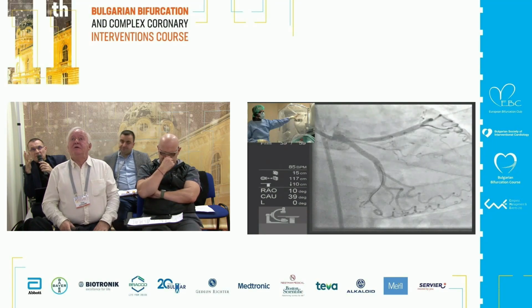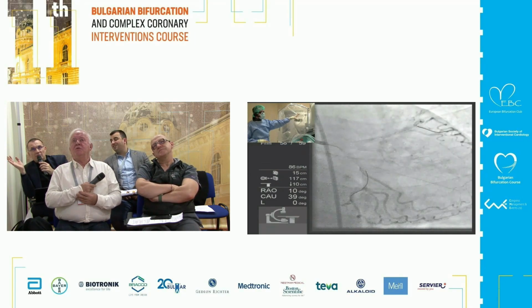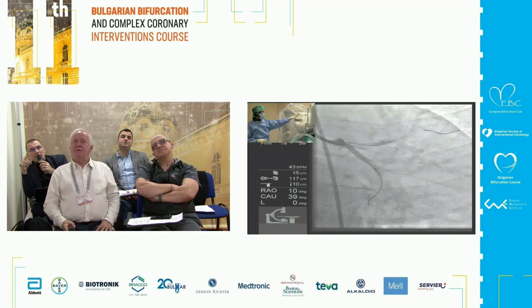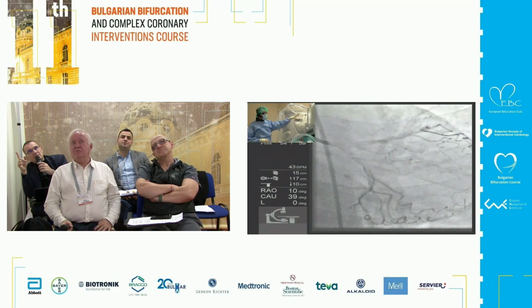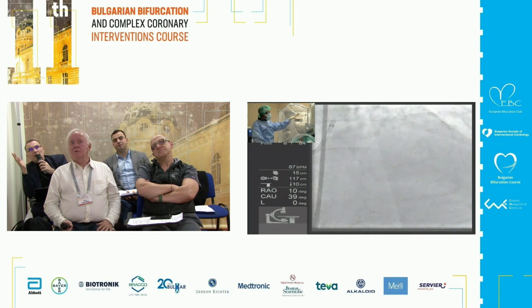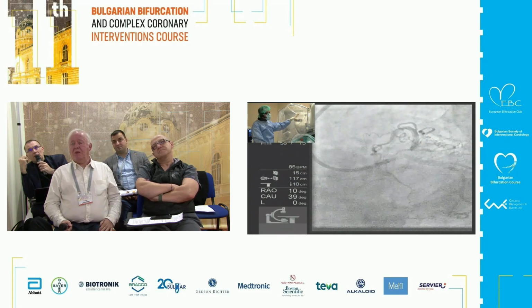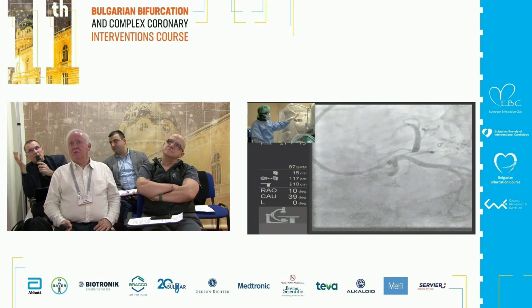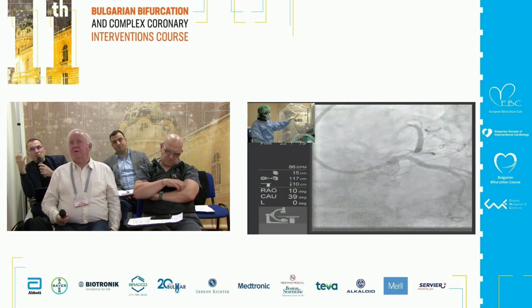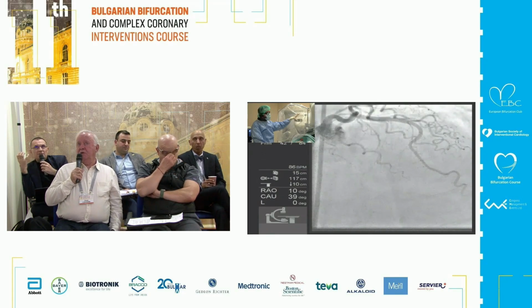This is 7 millimeters. 0.70 multiplied by 7 is 4.9. That means that for the POT you should use, let's say, 4.5 or even 5 millimeters. Yes, but there are a lot of people who are not so convinced and still rely on IVUS, and I think that it will be useful also for the young fellow just to see in reality that this is true.